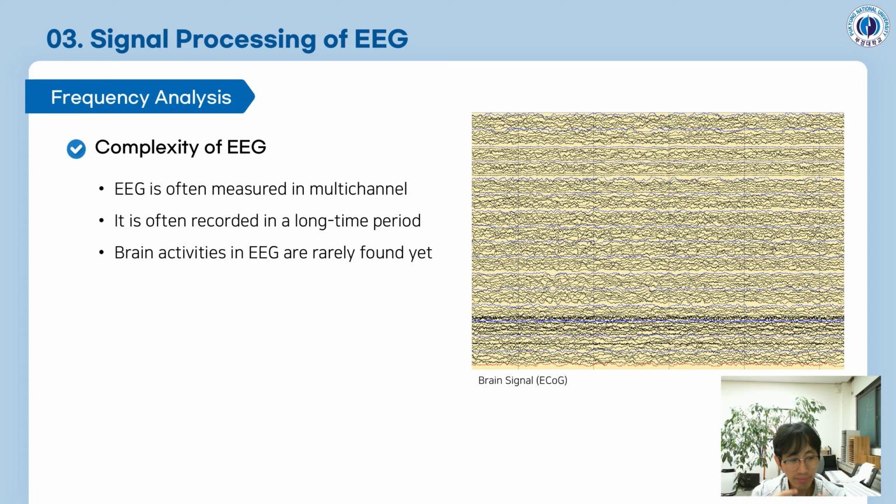Then how can you do it? A very simple way is to train a doctor, and then he's reading this signal continuously. Maybe it takes 2 days, 3 days, or a week, but he's trying to read some specific patterns from here, but it's very, very difficult.